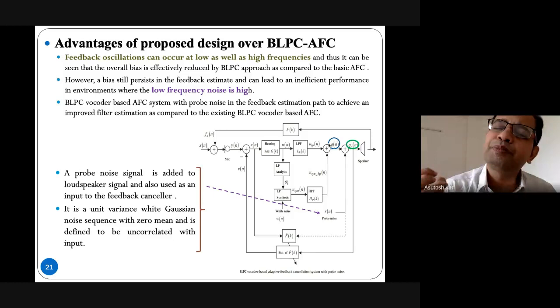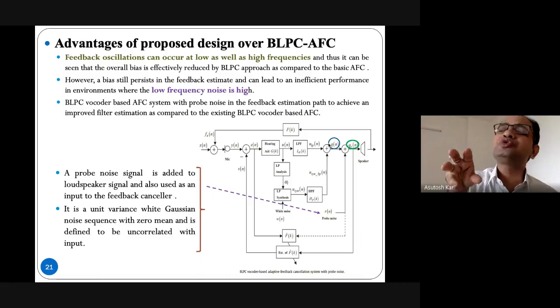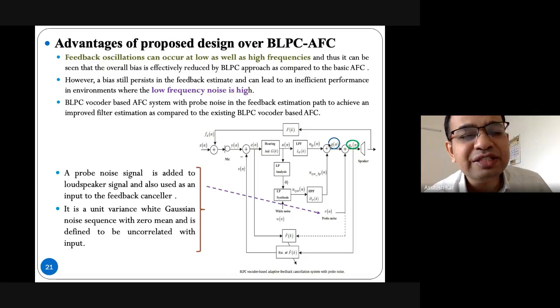When we try to insert it, we should be very careful. Otherwise, the speaker will produce the signal loudly. So along with the original signal, the hearing aid person will also hear the white noise or the noisy version of it. Then, rather than making the situation good for him or her, we are making it worse. Therefore, while selecting the probe noise, we have to be very careful.